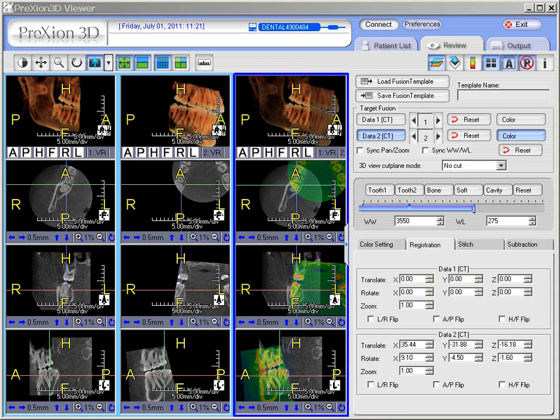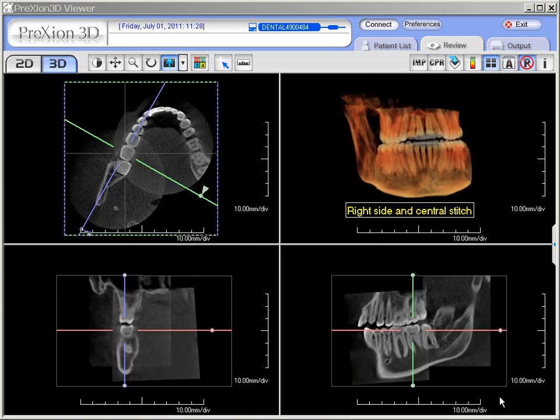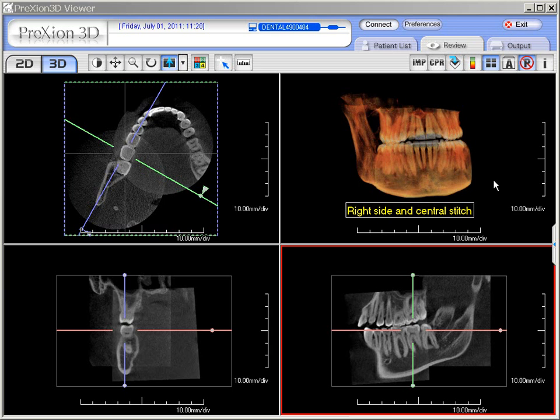For the purpose of demonstration, if we are satisfied with our fusion, what we do is click the stitch icon and then at the bottom we take our two fused data sets and click on stitch. The stitch will perform the stitching together — it takes about a minute — and then the two data sets are stitched together. When the stitch is completed, we have the right side and the central stitched together as one data set.